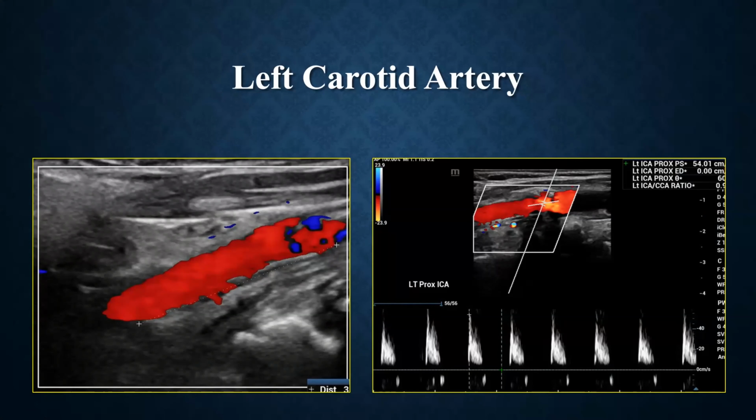It's changed. Very high resistance. Where's the diastolic flow? Doesn't exist. There's actually a reversal early in diastole and no flow. What happened? Well, hard to tell just from the grayscale or color Doppler images, as the vessel still looks okay. But something has changed. We now know because there's no diastolic flow, something must have happened downstream. There's a blockage that is outside our field of view.